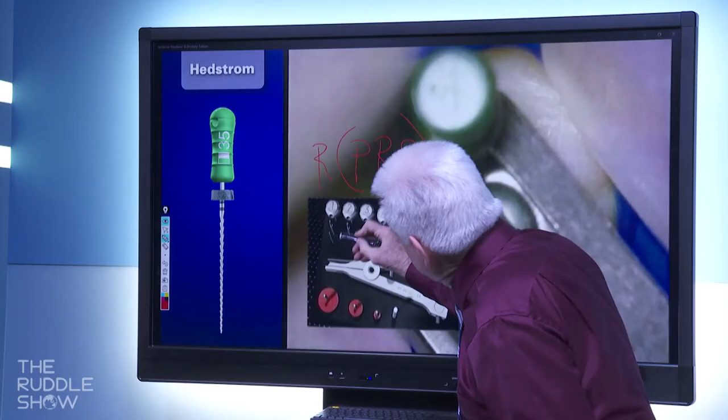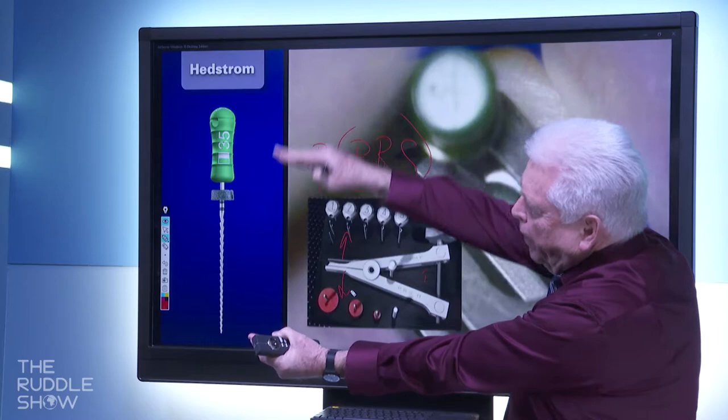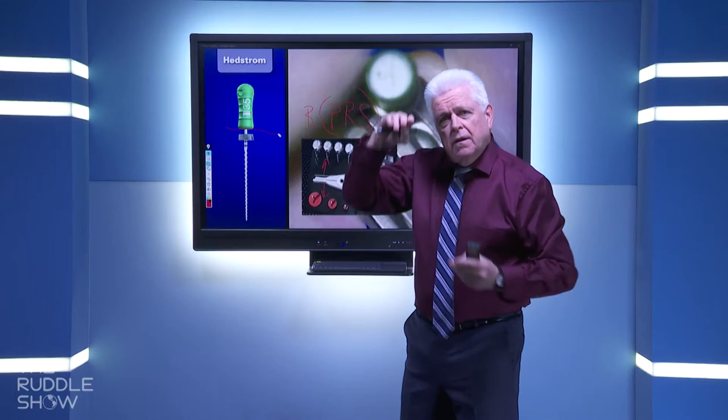these two jaws begin to separate. And these two jaws, one pushes down on the tooth, one pulls up on the handle of the Hedstrom, and you can, in a very controlled method, screw the knob and jack that silver point fragment right out of the canal. Let's take a look and see how that would work.